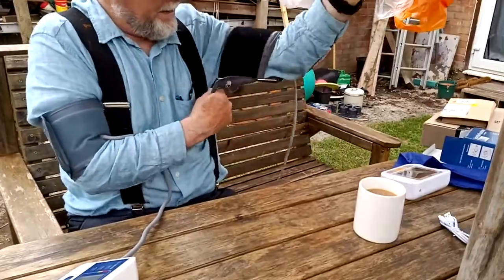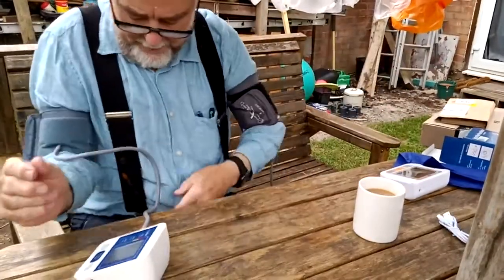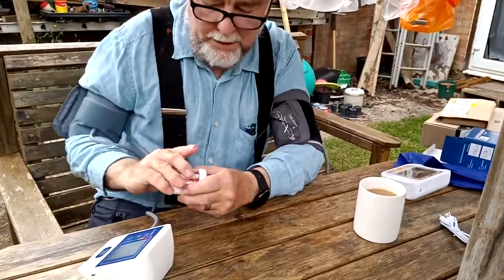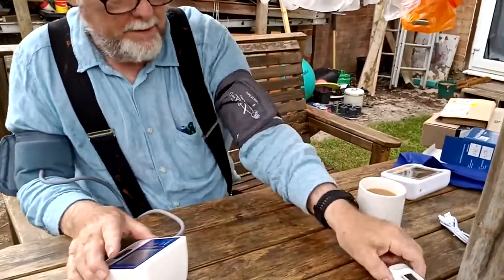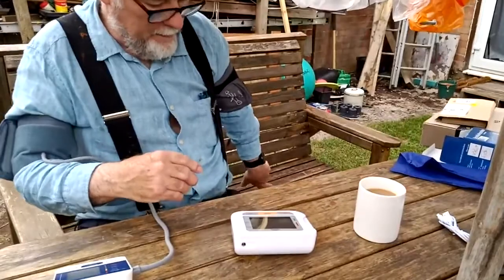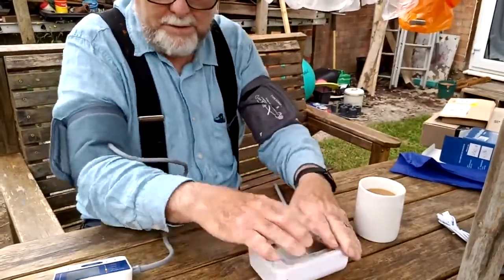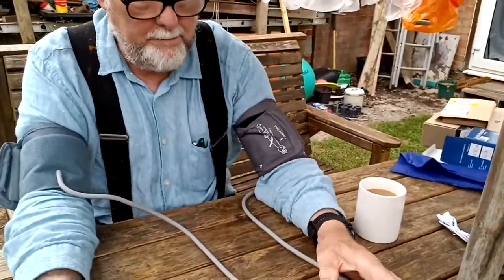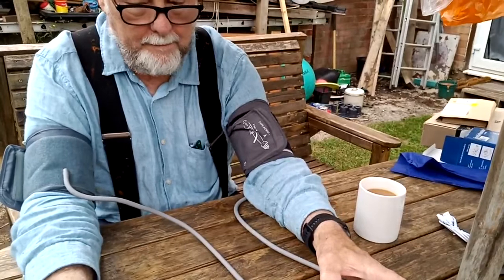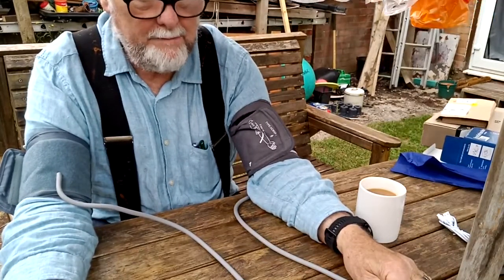So I'm just going to put my monitor that I've been using for a while on, which is, I'm reasonably sure, pretty accurate, because I've occasionally compared it with the results I get when I go and visit the doctor and so on. So I'm reasonably sure it's accurate. So put that on and plug it in. And we'll try and get our arms both as straight as possible. And off we go. They should in theory give roughly the same result.